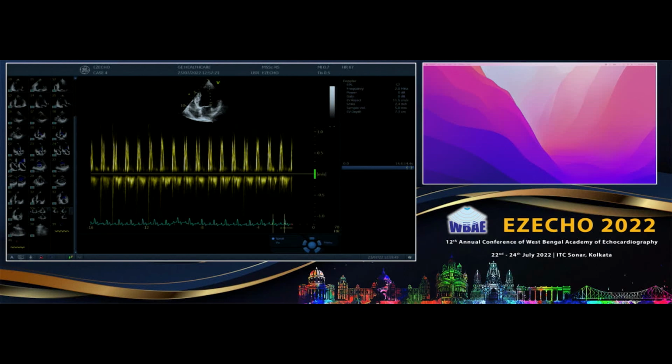In this patient, you can see that there is hardly any variability even in this longitudinal. No, but this is sinus. I'm just, we just wanted to show how to do it. Yeah, but that is sinus. We had the AFib earlier. Yeah, this is sinus rhythm, I think.